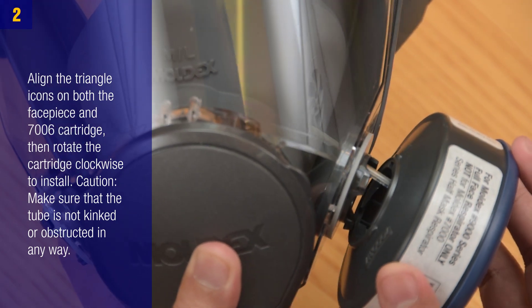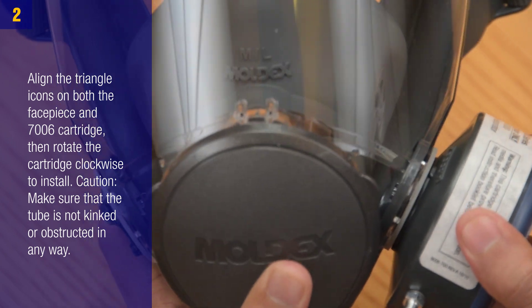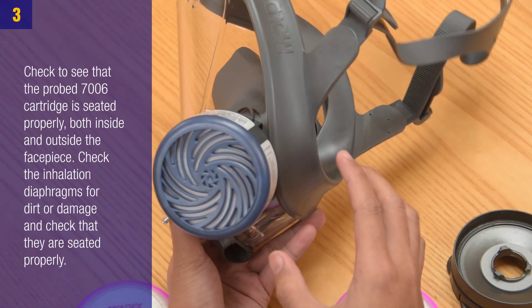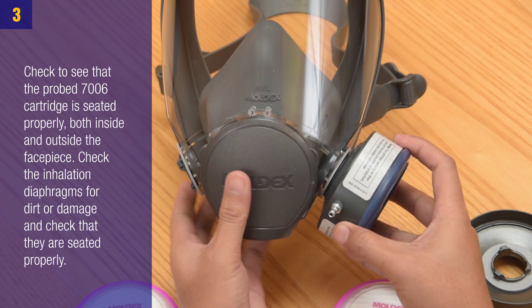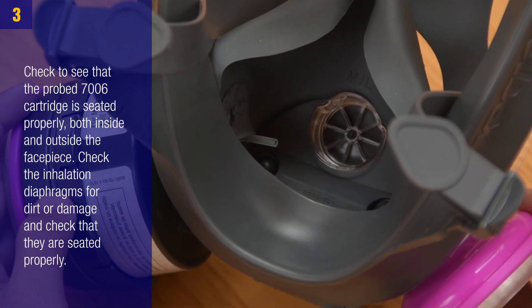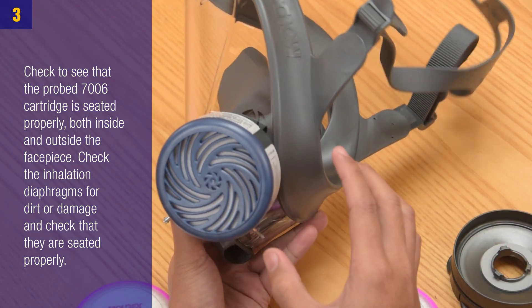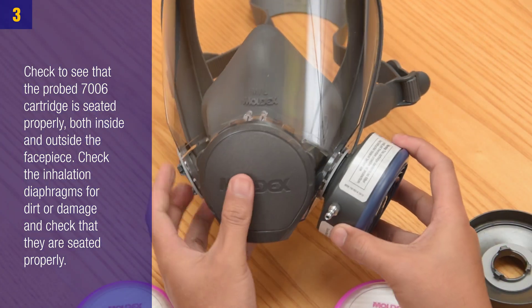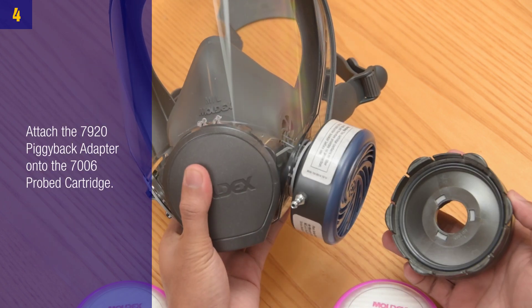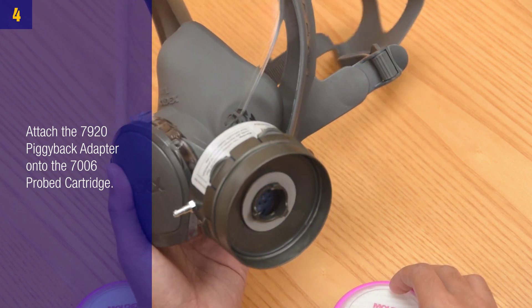Align the triangle icons on both the face piece and the 7006 cartridge, then rotate the cartridge clockwise to install. Caution: make sure the tube is not kinked or obstructed in any way. Step 3: Check that the 7006 probed cartridge is seated properly both inside and outside the face piece, and check the inhalation diaphragms for dirt or damage and that they are seated properly.